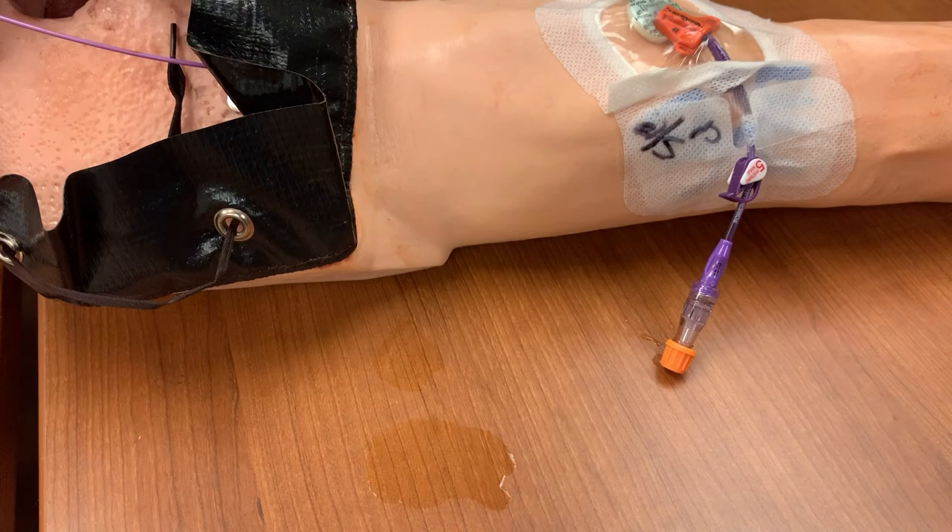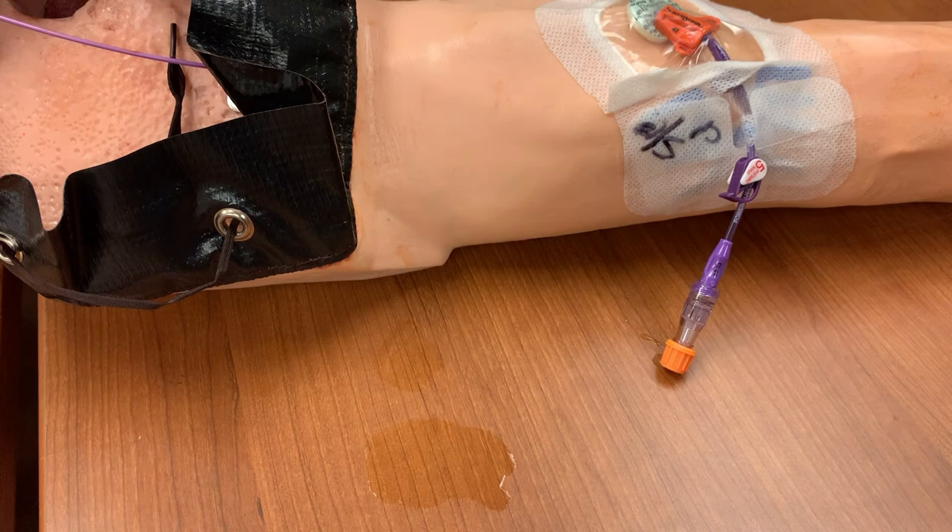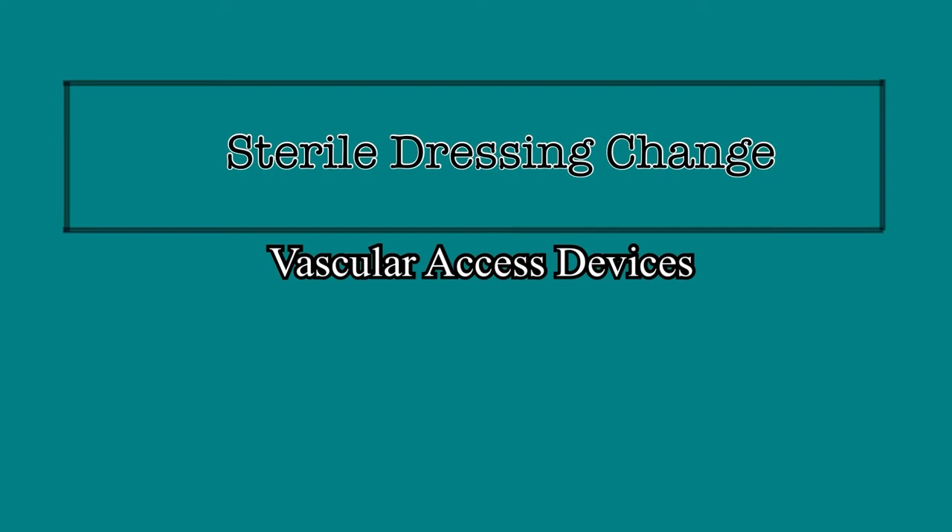When the line is not in use, always have the pinch clamp in the closed position. This provides positive pressure in the line that keeps blood from entering the end of the catheter and forming clots. The vascular access team will round on PICC, central, and midlines daily, and if necessary, they'll change the dressing. But there is no reason that a dressing must be changed by the vascular access team. If a patient's dressing is outdated, damaged, or dirty, every nurse should feel confident that they have the skills, knowledge, and supplies to safely change that dressing in an attempt to keep their patient safe and keep the catheter viable to deliver life-saving medications.